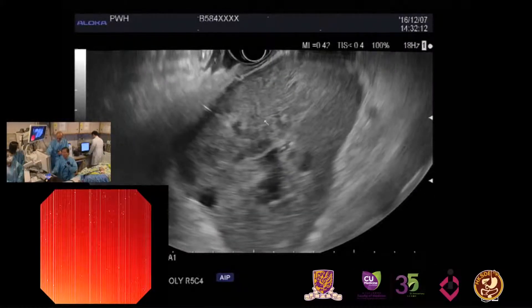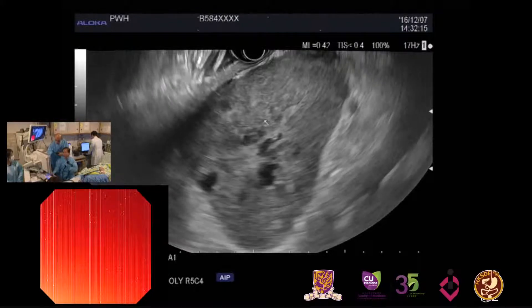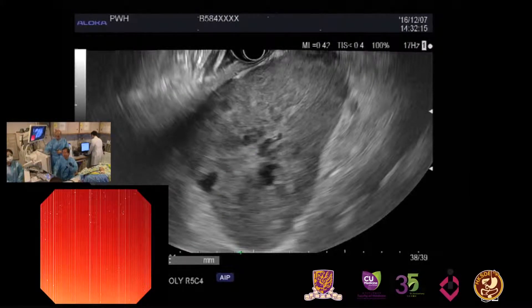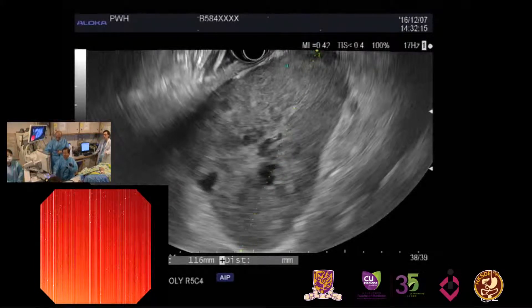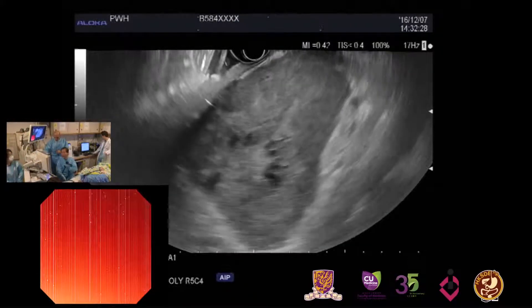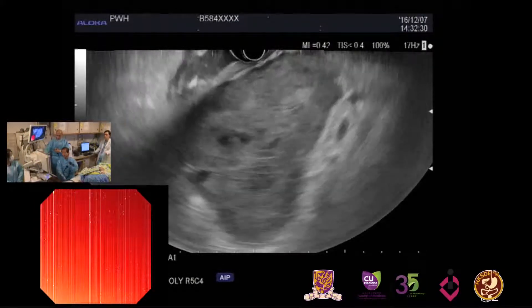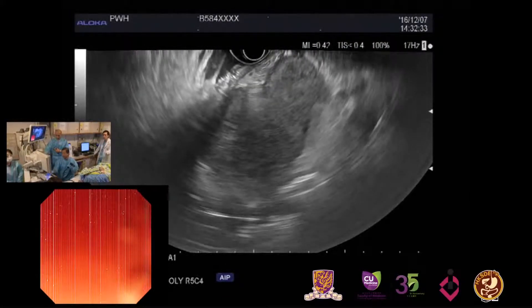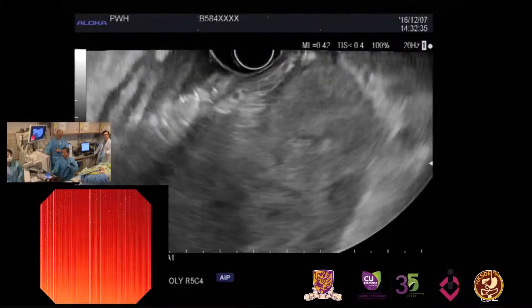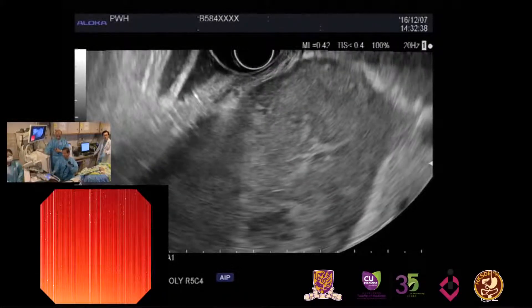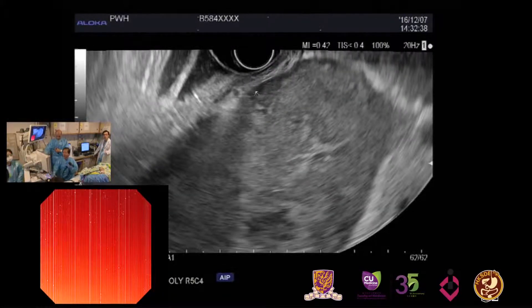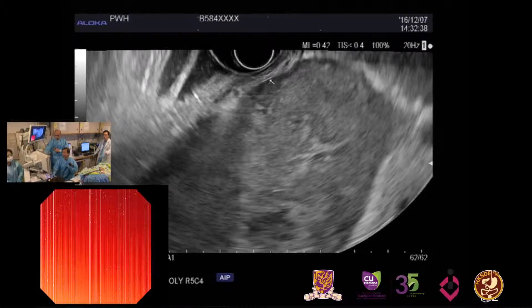This is a very large region. To visualize this region we need to adjust the penetration. If you measure the dimension, it is probably more than 11 cm. So a very large and huge mass. If you see just this plane, it looks like it is located outside of the stomach. This is the gastric wall here, and this side also the gastric wall, but the main region is located outside of the gastric wall.